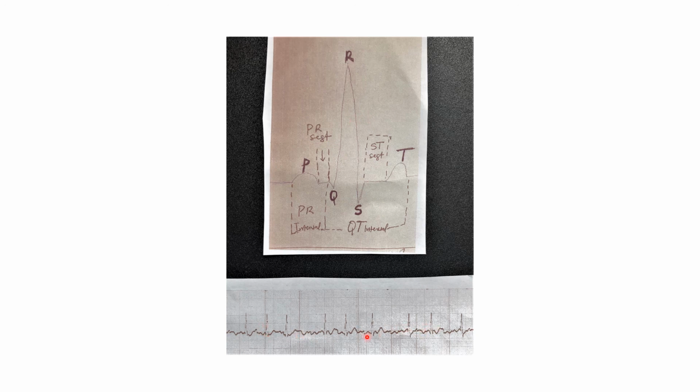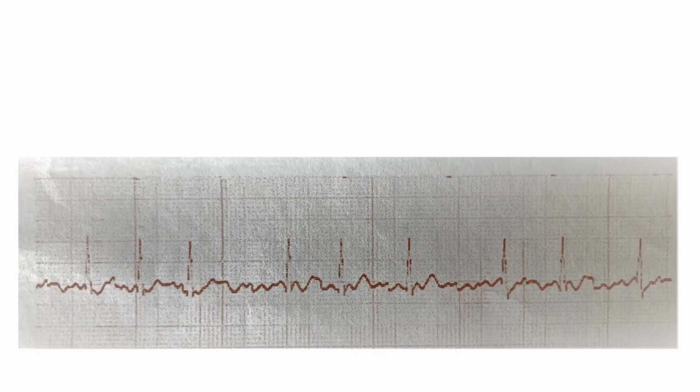the EKG of an individual with atrial fibrillation. It is irregular. The same here. Because of copyright issues, I cannot get more than this for now. But when you study this, this is irregular. You can trace it out.